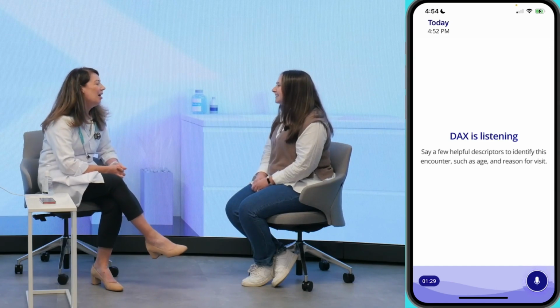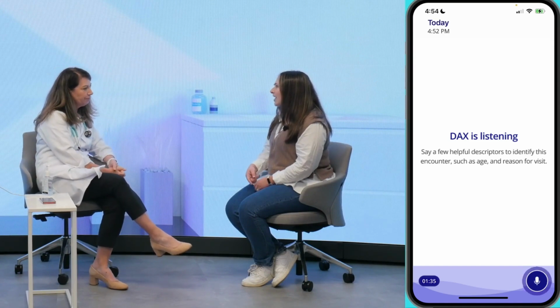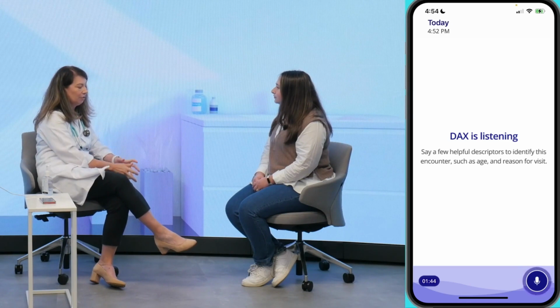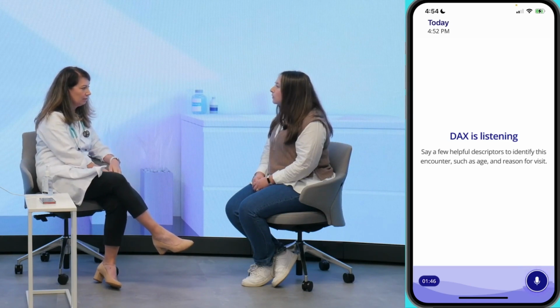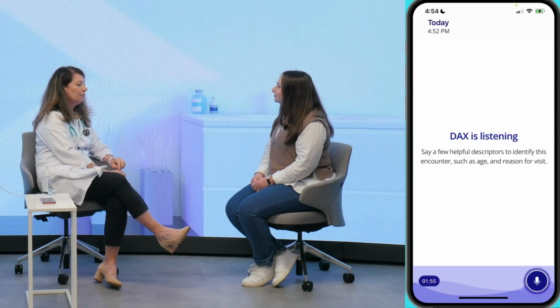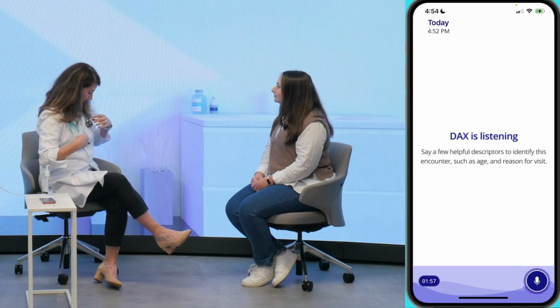Yeah. So. Now, any other medical problems that I should be aware of? I had a blood clot in my left leg about 2 years ago, so I'm on blood thinners. Okay. Now, since you traveled, do you have any shortness of breath at all? No. Okay. And have you noticed any leg swelling or anything? Nope. I wear my compression socks daily, so no swelling there. Okay. And you're following up with your hematologist? Yep. Okay. All right. Now, I want to go ahead and just do a quick physical exam.